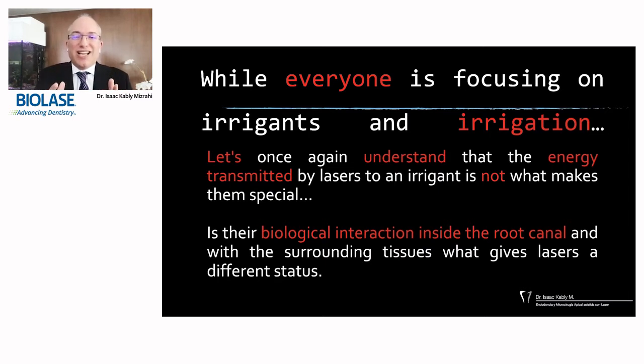It's the biological interaction inside the root canal and out, with the surrounding tissues, that gives the laser a different status. I do not focus on the mechanical action lasers induce inside the root canal. It helps, yes, it helps. But again, you cannot control the amount of extrusion, and thus irritation of the periapical tissues, you get after this irrigation liquid leaves the root canal spaces.